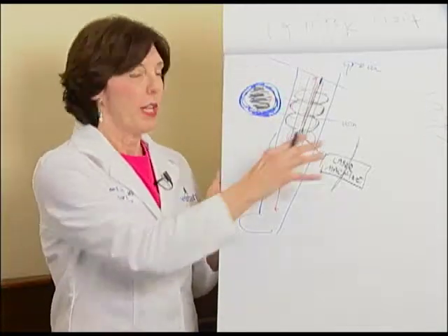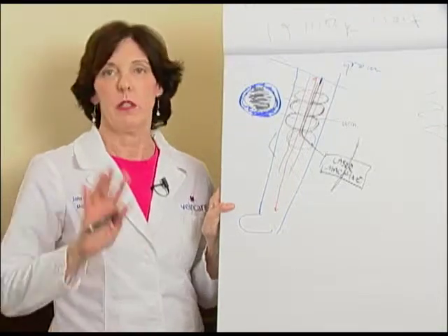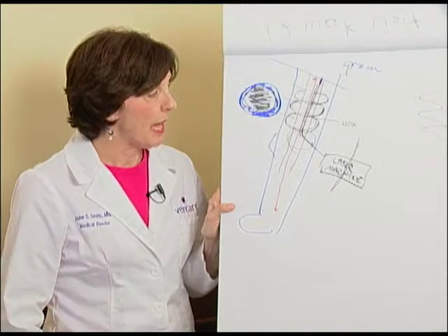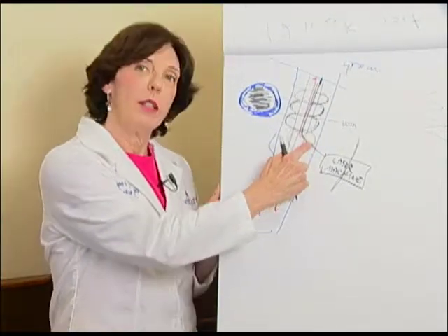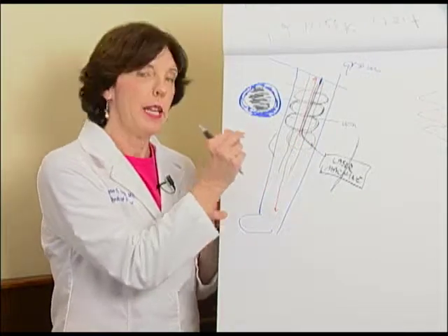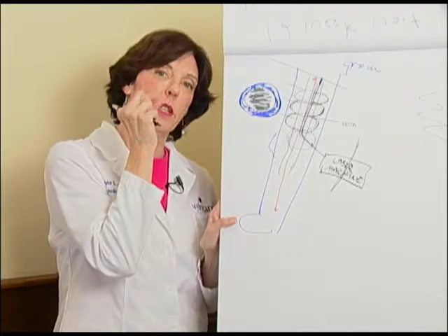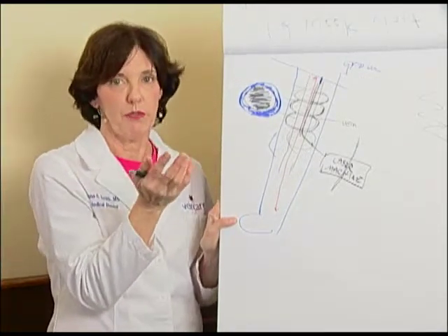Now, when you're done with that, first of all, this area will be numb because we've numbed it, which is a good thing. We don't want you to feel anything. And you will have one little area where we've inserted the tubing that is teeny. I try to make it so you can barely see it the next day, and you will basically have no scarring.